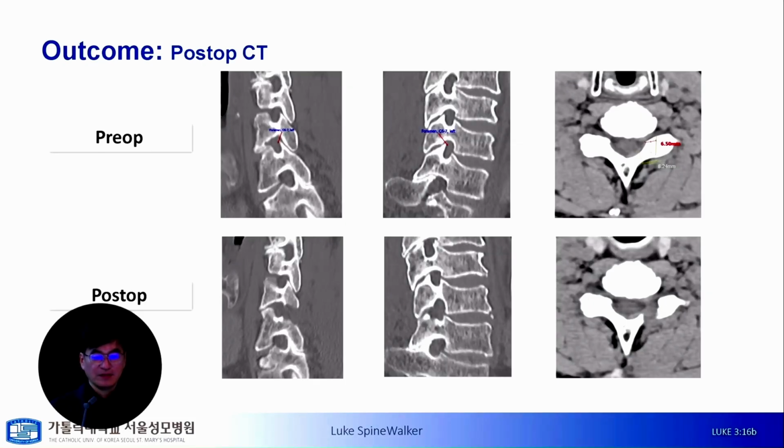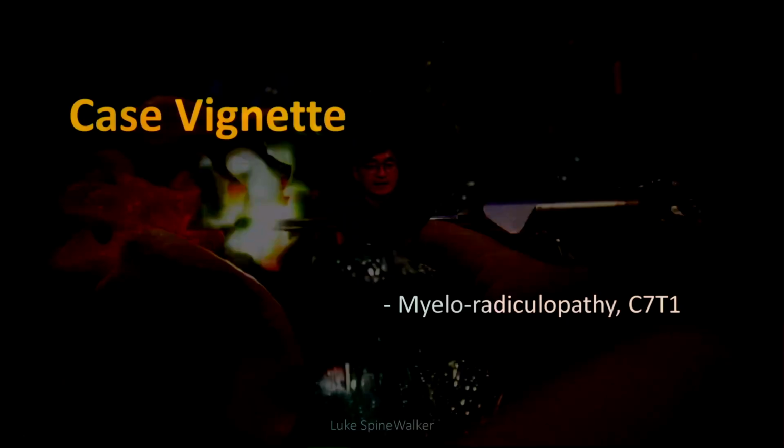Some surgeons evaluate the patient with CT too many times. Post-op CT is not mandatory, but it is one of the good tools to increase your learning curve. You can reflect on your surgical performance by the images, right? So the target on post-op CT should be exactly the same as the pre-op targeting, right?